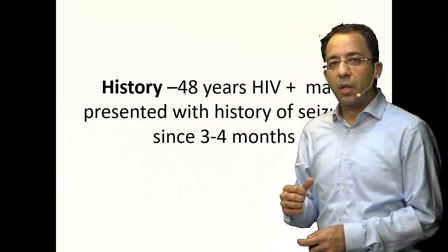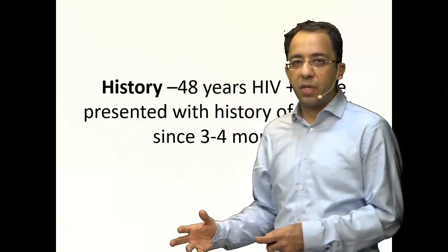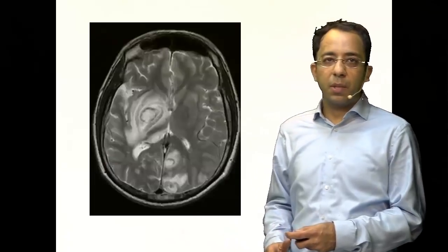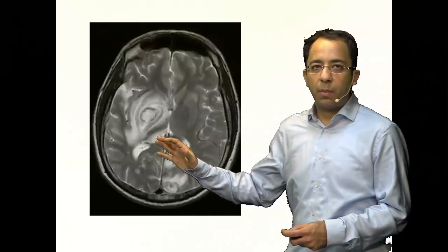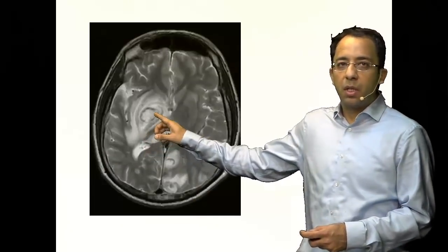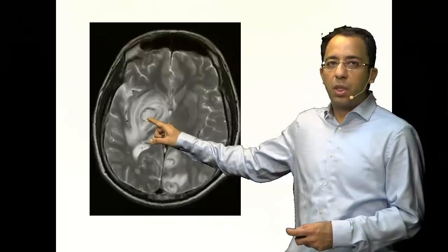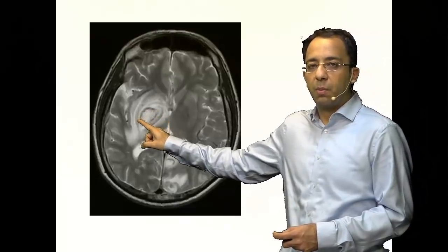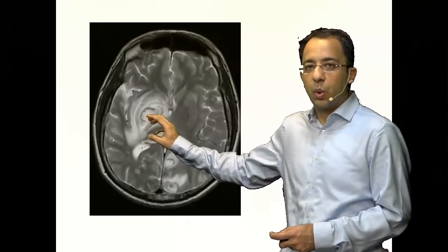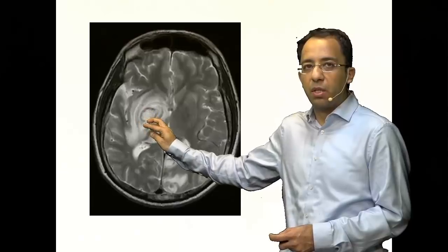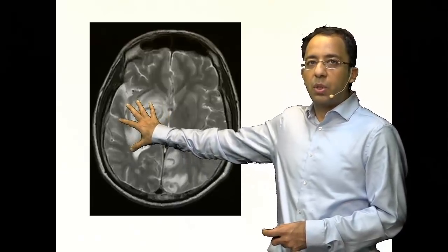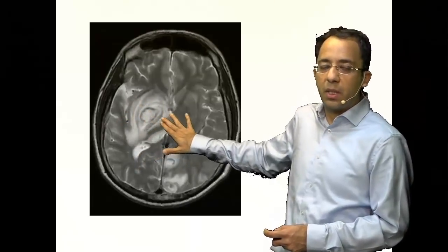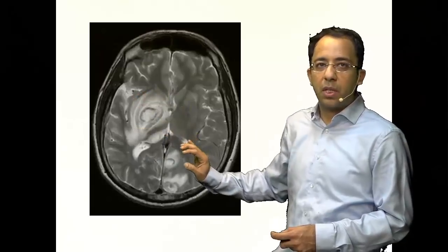Looking at the MRI image — this is a T2-weighted image. You can see a T2 hyperintense lesion which has a hypointense rim around it, so it is a bright lesion with a dark rim around it, with surrounding edema.